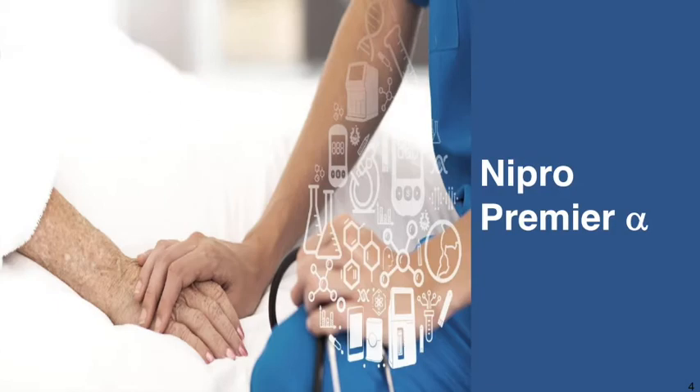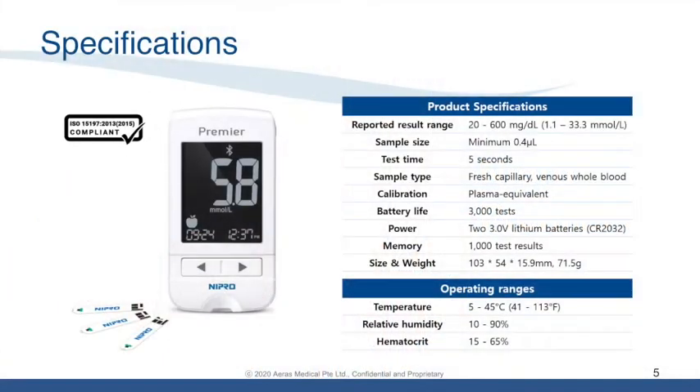The Nipro Premier Alpha is an EN ISO 15197:2015 compliant blood glucose meter. To highlight a few key points: it is capable of storing up to 1,000 test results at any one point, with a battery life lasting 3,000 tests. Its required blood sample size is very small — only 0.4 microliters. It is also able to operate within a hematocrit level of 15% to 65%.